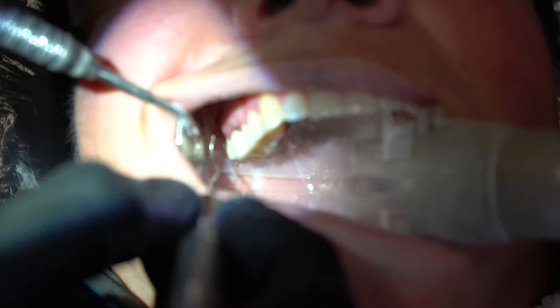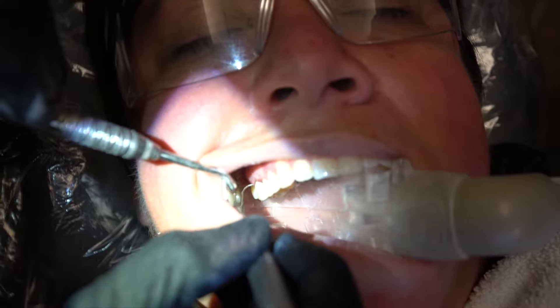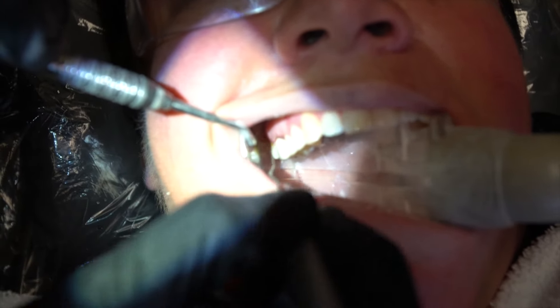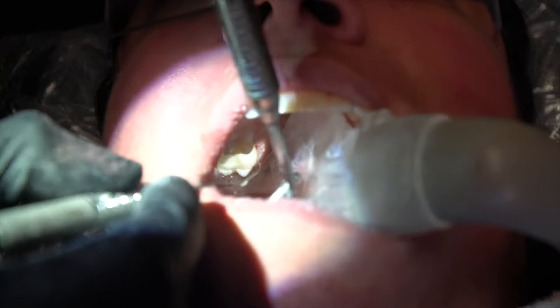The crown is cemented now and we have a really nice fit. In evaluating the crown, we want to see that the crown margin is flush to the tooth. When you go from tooth — which I'm on here with the explorer — and come up to the crown, that's seamless. There shouldn't be a catch or a bulkiness to the crown. That's an area where bacteria is going to collect and irritate the gums, which Jackie had in her case, or create a cavity, which she also did. Nice and flush — that is going to ensure the crown lasts the maximum amount of time. Same thing on the other side, nice and flush.